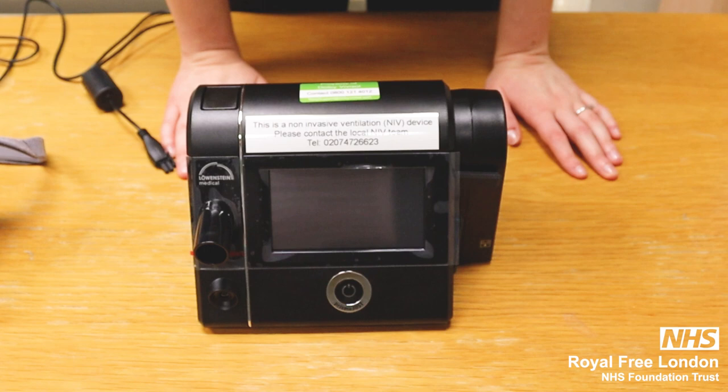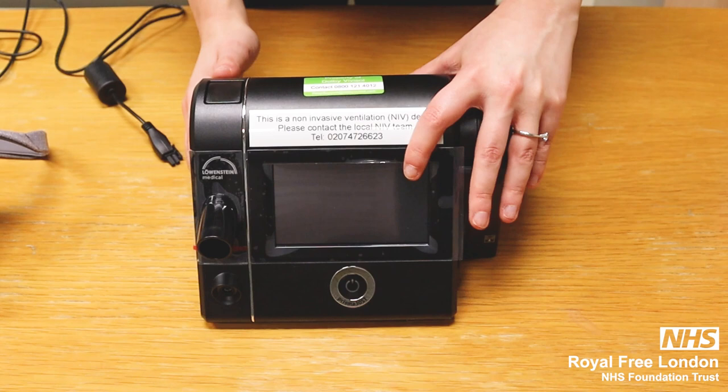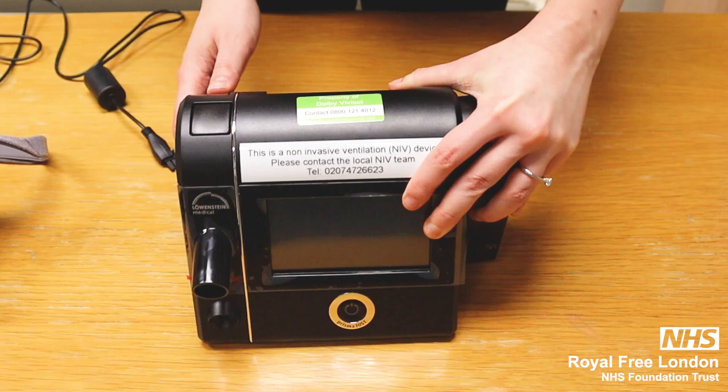Good afternoon. Today I'm going to explain the home non-invasive ventilation device called Prisma 30ST. If you need to contact the company, you have a sticker on the top with the contact number if you need any support.